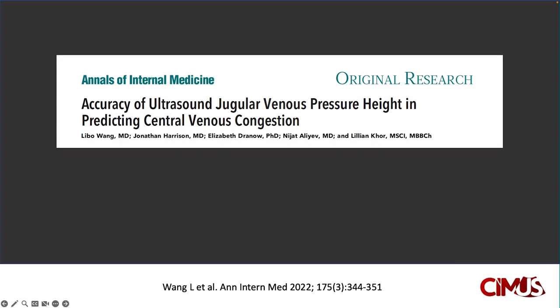While multiple approaches to examining the JVP using ultrasound have been published, this video will go over one technique described in the Annals of Internal Medicine in 2022. We find this technique relatively easy to learn for the average learner, and it correlates directly with what clinicians are already doing at the bedside when examining the JVP using physical examination technique.